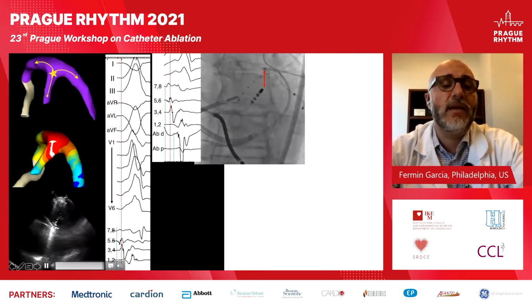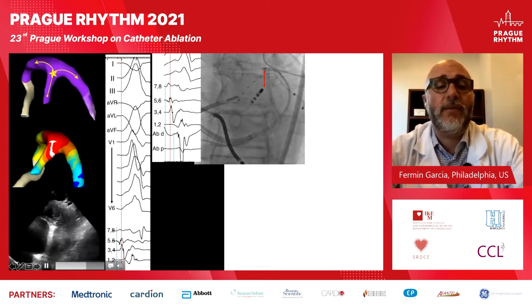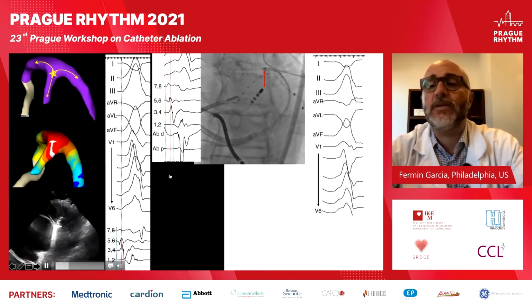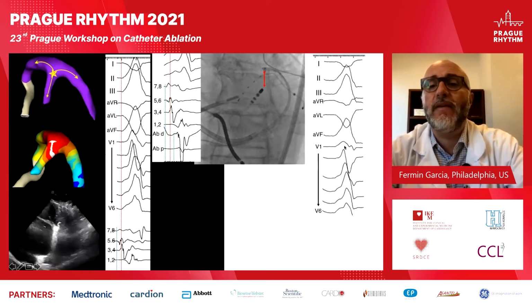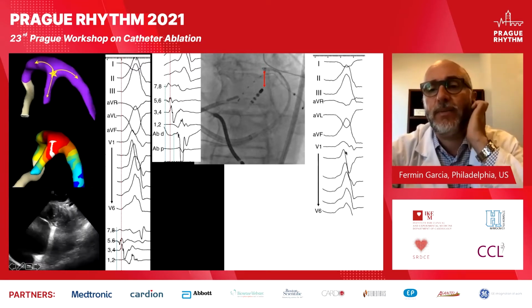You can see here in intracardiac echo, this is the LVOT, the left atrium, and you can see the catheter very, very basal, opposite to the actual duodeca catheter, which is coming down here with the tip on the septum. And a lesion here didn't eliminate the PVC. However, when you pay close attention to the morphology of the ECG, V1 changed. So you have a change of the exit of the PVC.